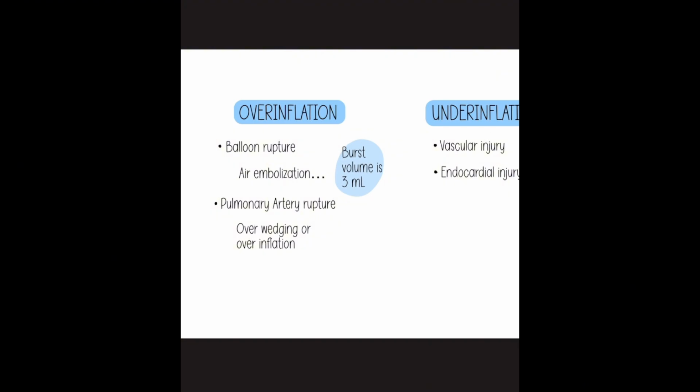You push it so far into a distal PA branch or a smaller branch that when you inflate, the balloon bursts that vessel. And that's very bad because it's very difficult for us to tamponade in that area to stop the bleeding, and that can progress very quickly. So this is why the rule for inflating the balloon isn't just automatically go up to 1.5 because that's suggested.